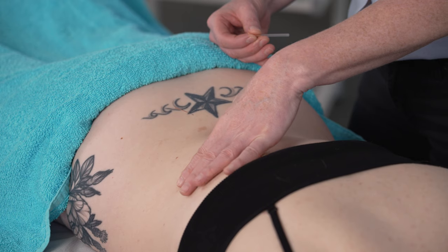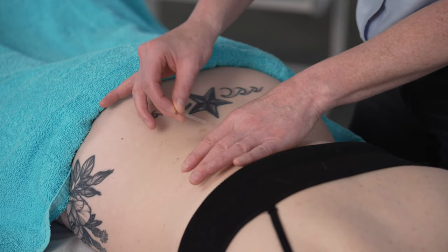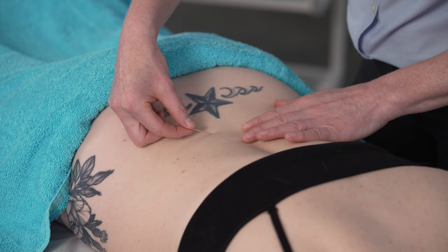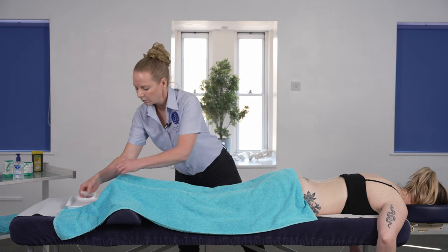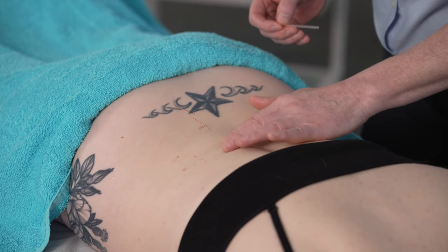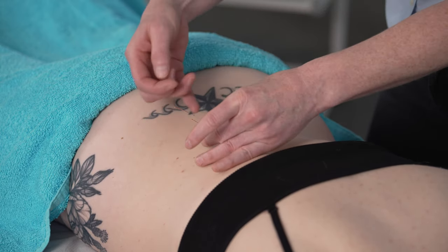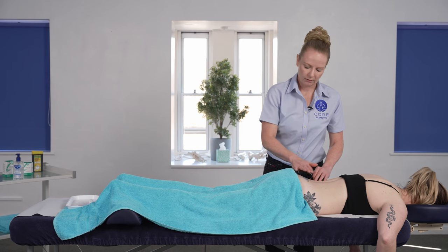Coming back for the second needle, again returning to the spinous process to measure, then going about one to one and a half thumb widths away. I can feel that I'm on that muscle group — feeling for tension and abnormality — then angling the needle pressing in towards the spine. The needles are angling towards that transverse process. Just doing one more here to demonstrate again: feeling for trigger points, feeling for tension in the tissue, coming back to the spinous process one to one and a half thumb widths away. When putting multiple needles in, make sure your hand position isn't pressing on any of the earlier needles — move the hand around so that you're not accidentally pressing on the needles that are already in there.